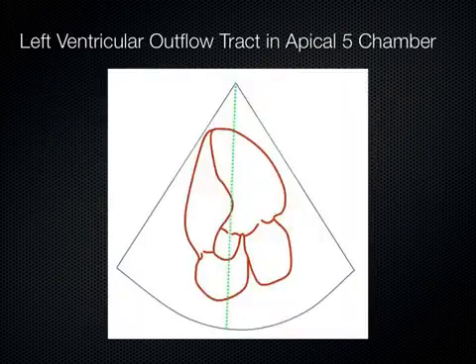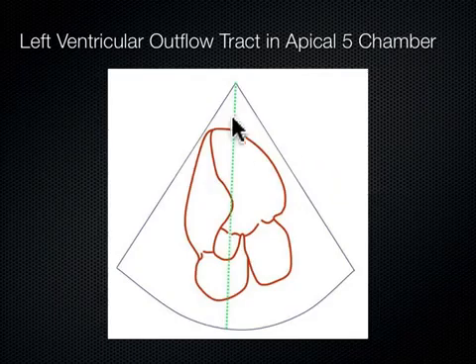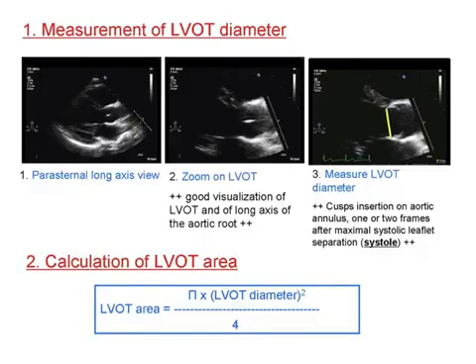Now, that left ventricular outflow tract seen in that apical 5-chamber view, this is just a schematic of it. This is where you're going to be dropping that Doppler gate right through here. And somewhere along that gate, you'll see that little TIE fighter looking thing. That's going to be just somewhere right on the edge of this aortic valve, just right along here. That's where we're going to be dropping that Doppler little TIE fighter, in this general vicinity in here. And that will set us up to measure the cardiac output. Let me show what I mean.